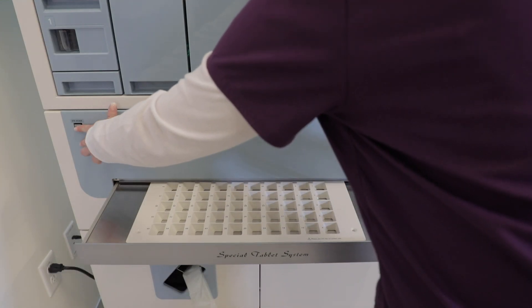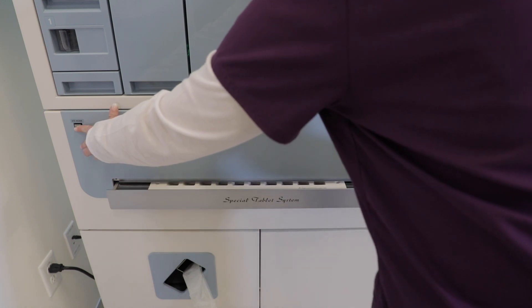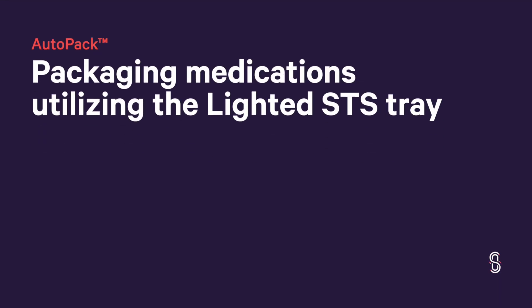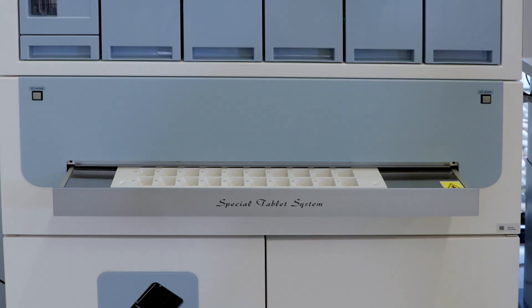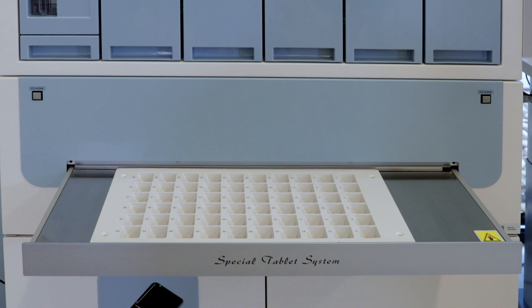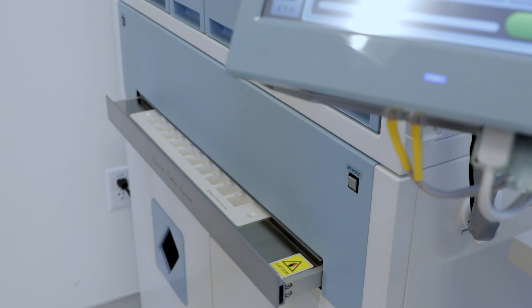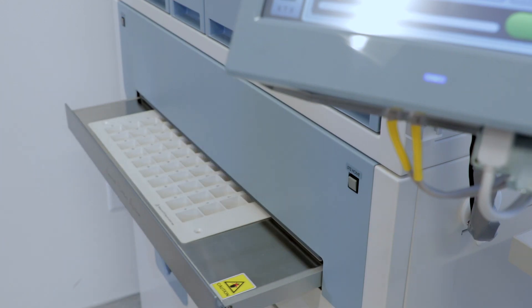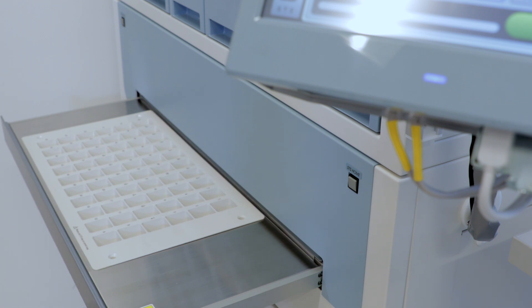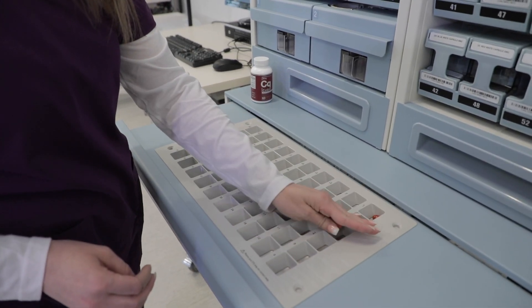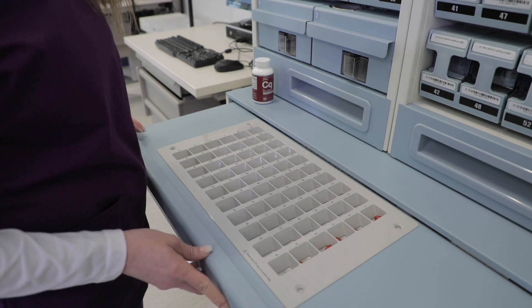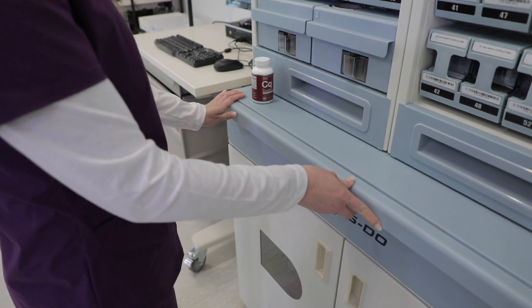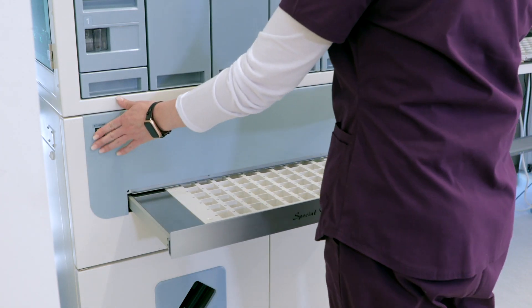When only needing to package smaller quantities of medications, the lighted STS tray is a great counterpart of the AutoCanister. The AutoPak lighted STS tray is useful for packaging less frequently used tablets, half-tablets, or special-shaped tablets. The STS tray has 60 individual cells to hold medication for packaging. Each cell could be filled with a distinct medication type, enabling multiple orders to be packaged at the same time.